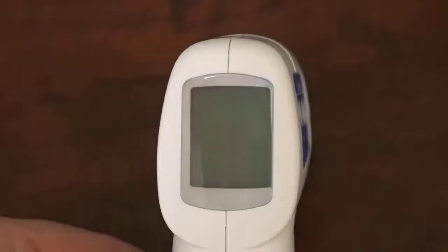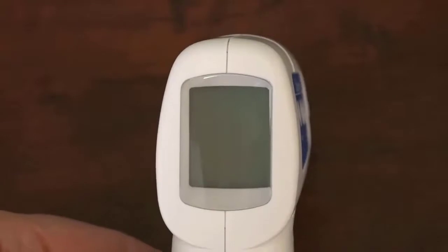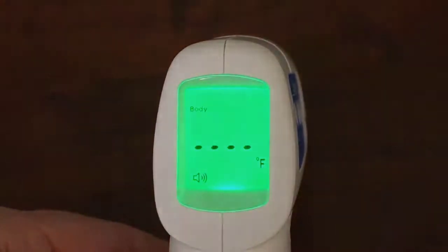By default, the unit comes in Celsius scale. Press the trigger to turn the unit on. The home screen is displayed.